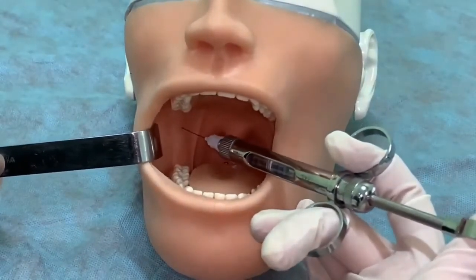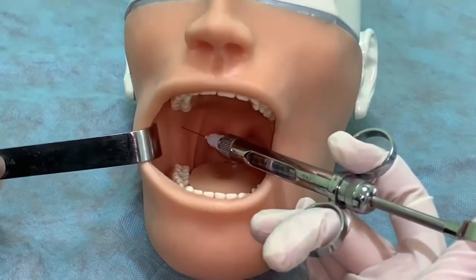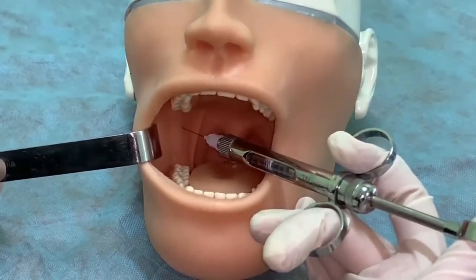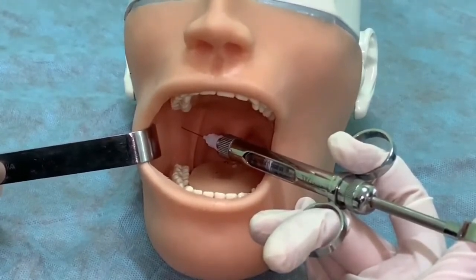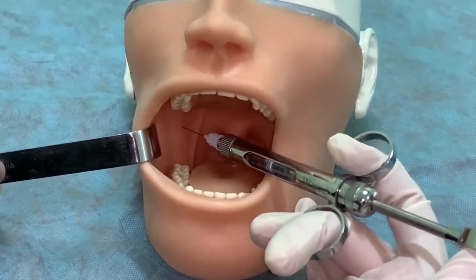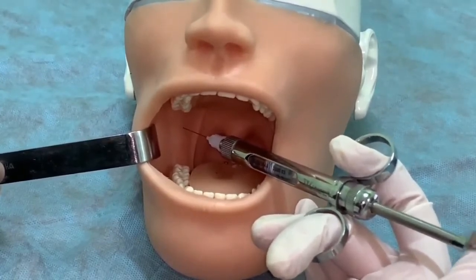Take a carpal syringe with a needle. The syringe should be placed over the opposite molars. Inject the needle in the front of the pterygomandibular fold, receding down 5 mm from the crown of the upper third molar. Push the needle into the soft tissue 15–20 mm to the bone. Perform an aspiration test and release the anesthetic.